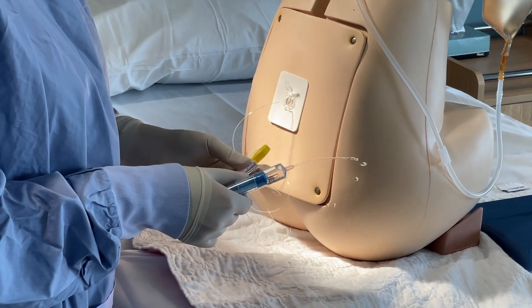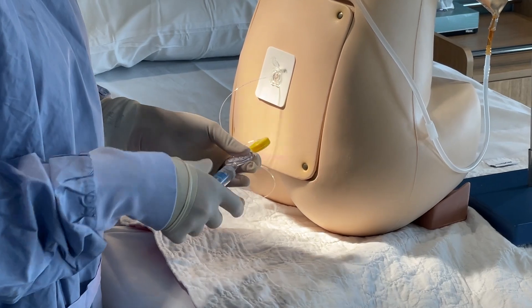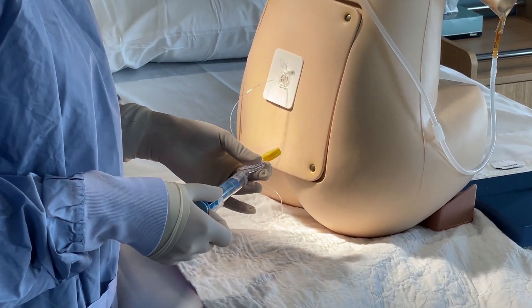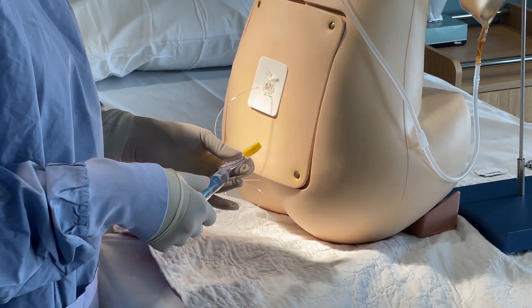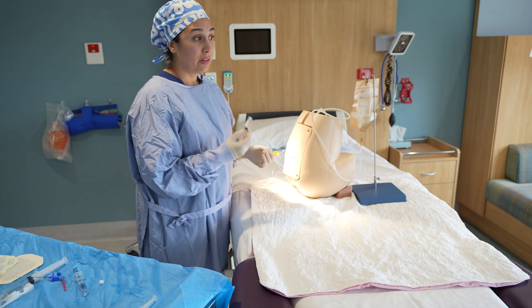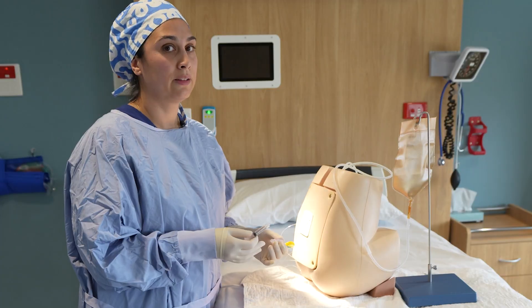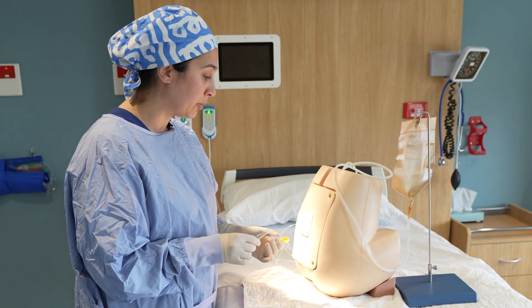Always check with negative aspiration that there's no blood coming back and no obvious free flow of CSF. Once confirmed, tell the patient you're ready to load the epidural and notify your midwifery colleagues, as this starts the clock for epidural observations.